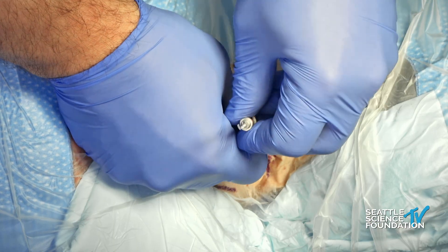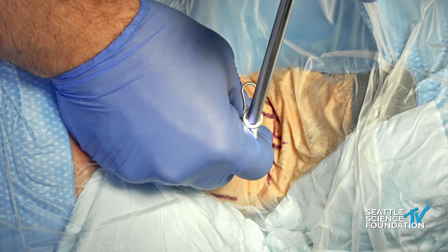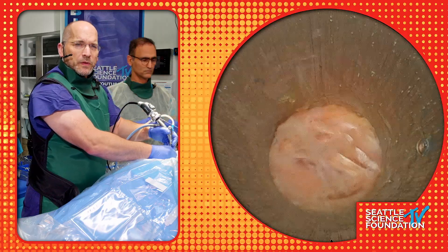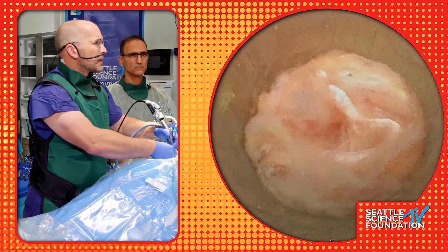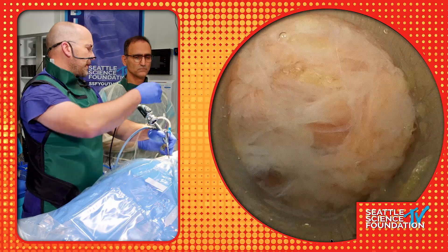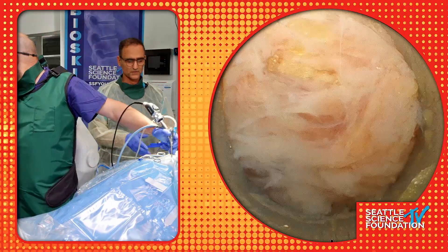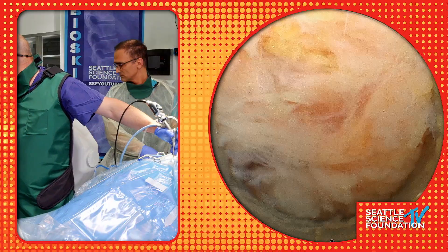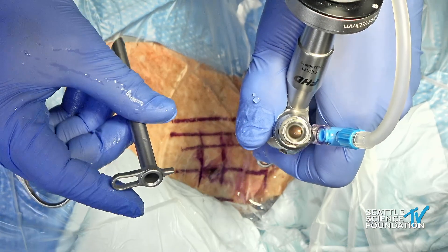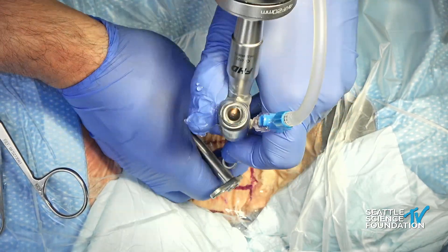That looks pretty good. Can I have the endoscope? Regarding the bevel orientation — the bevel faces medially, so you get more flush to the spine that way. The tubes are designed open towards the medial round area. So the bevel is always open medially, and now we are right on bone — I can actually palpate the bone.